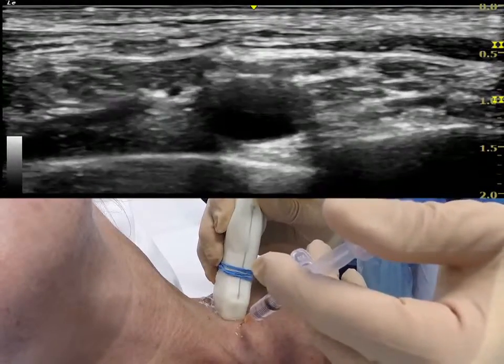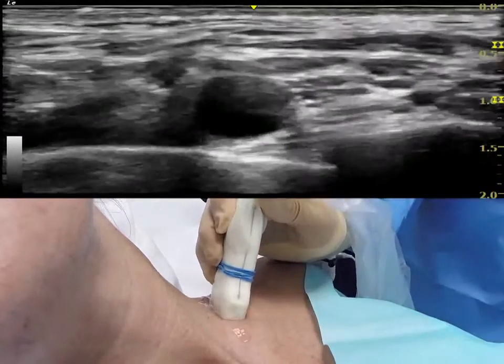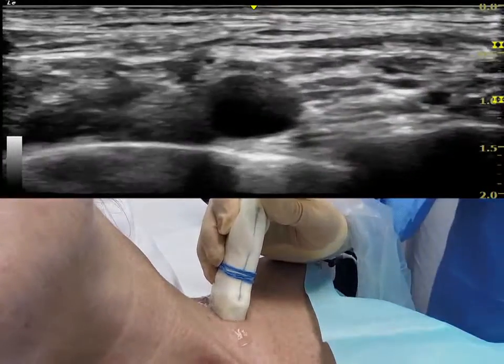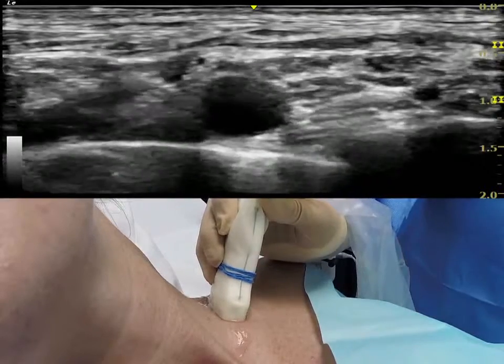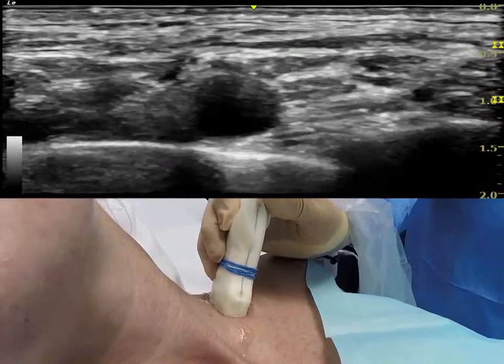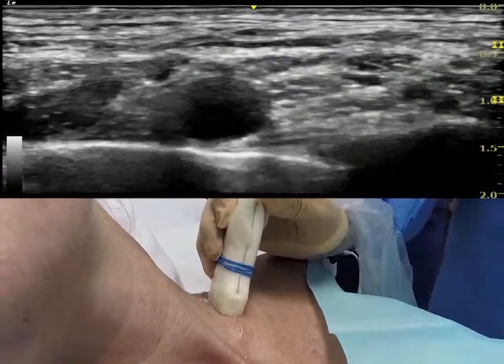We find it less prone to dislodge with patient movement. This is an aseptic technique and in this case we've used a less restrictive drape just for the purpose of videoing. We start with local anaesthetic infiltration of the skin.